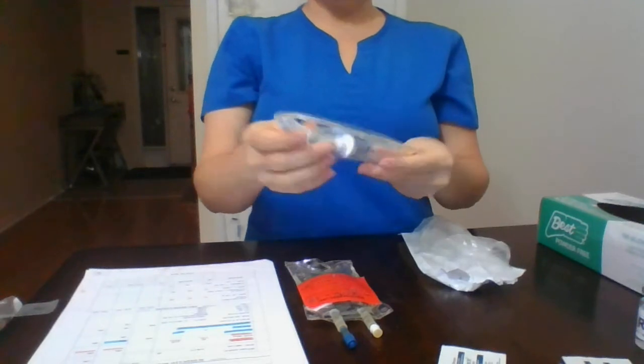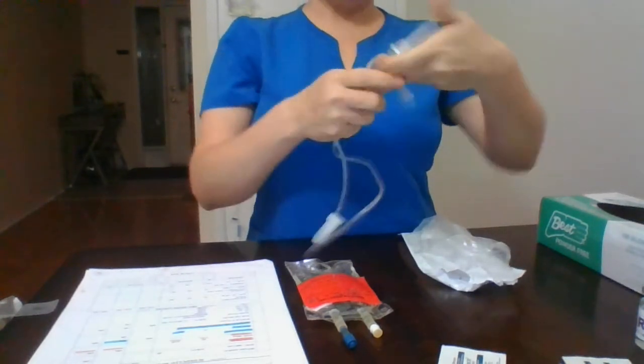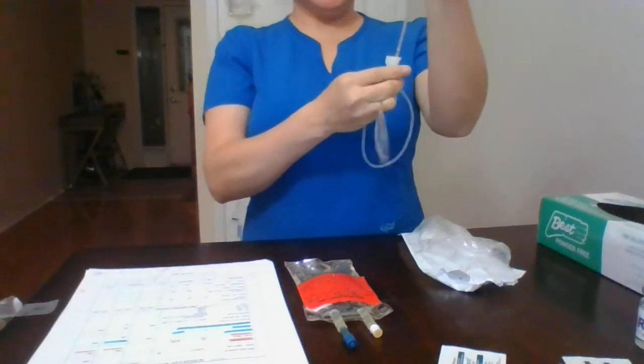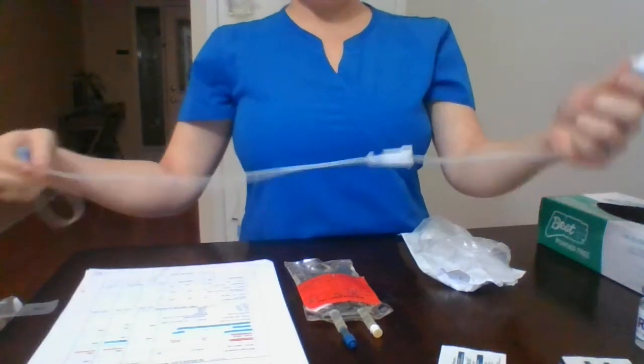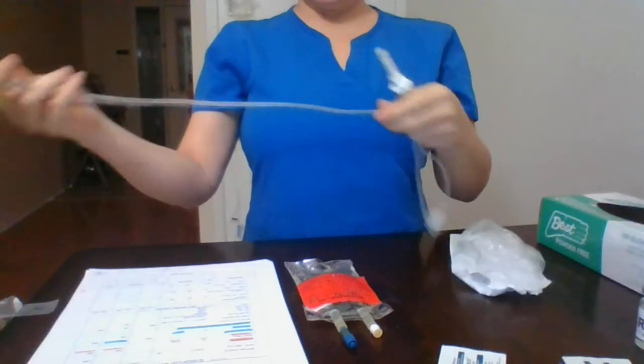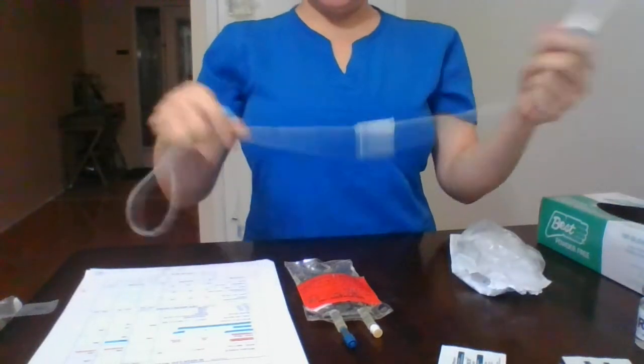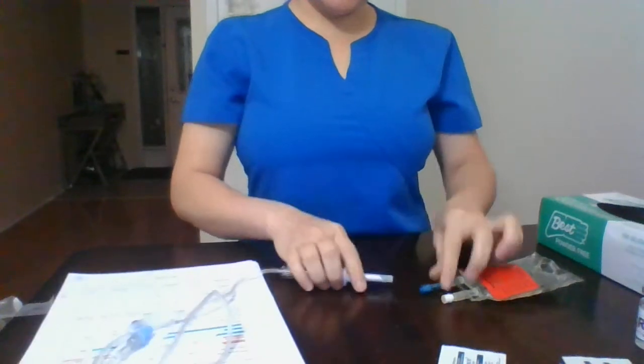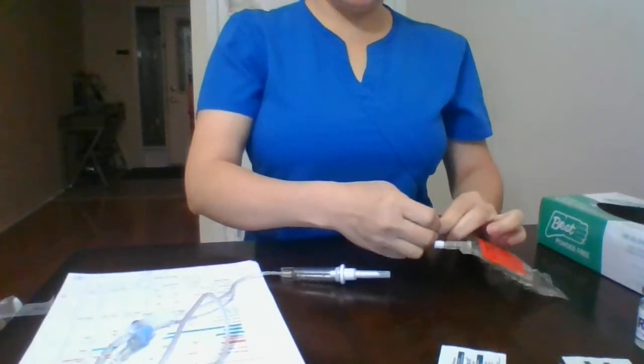So the first thing I will do is I will make sure that my clamp is all closed. Okay, it's already closed and good. So the next thing I will do is to connect my port with my mini IV.